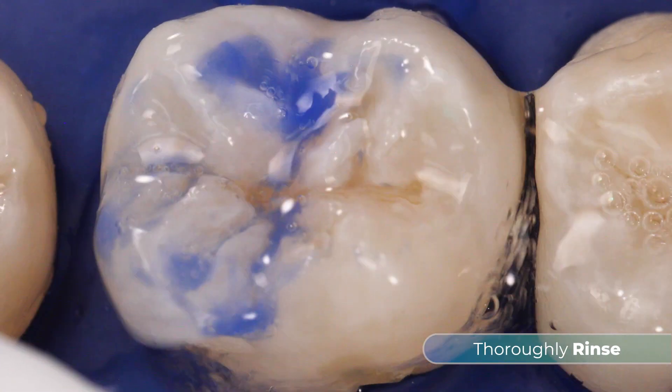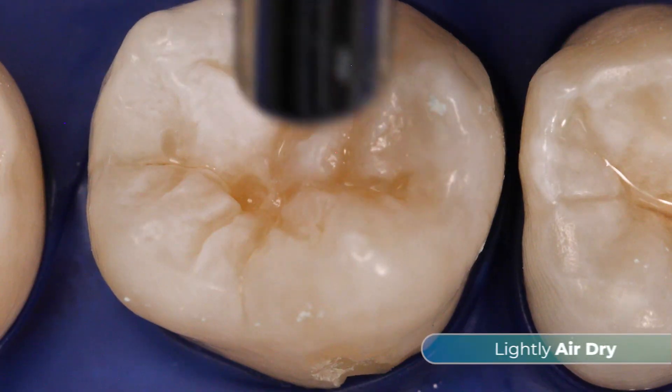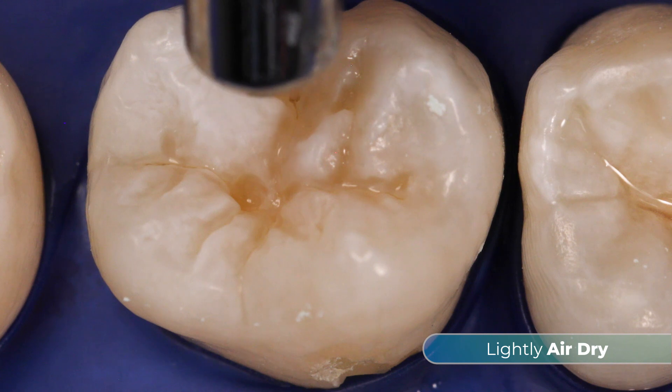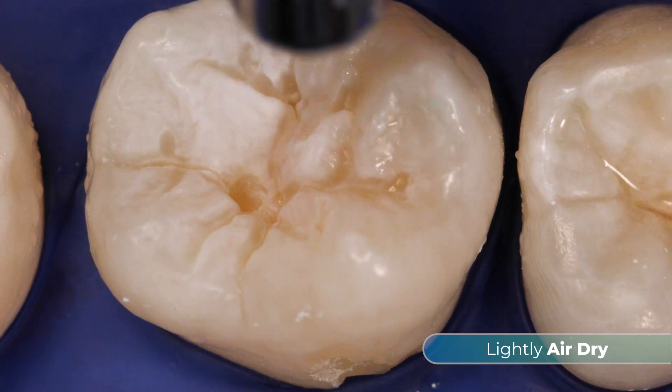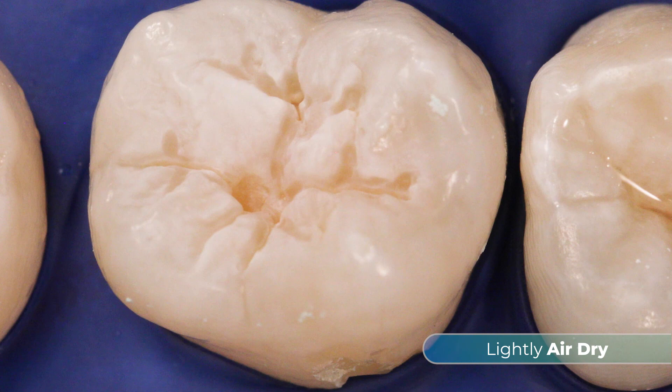Thoroughly rinse the tooth. Lightly air-dry the tooth to remove visible moisture. This allows the hydrophilic chemistry to flow deep into the pits and fissures. Do not over-dry or desiccate the tooth.